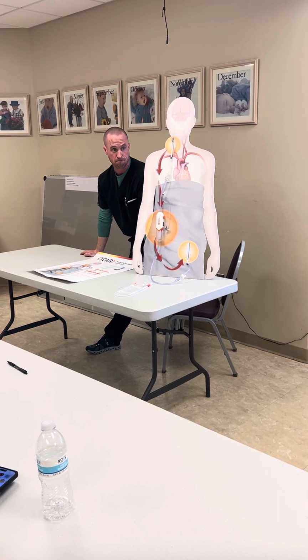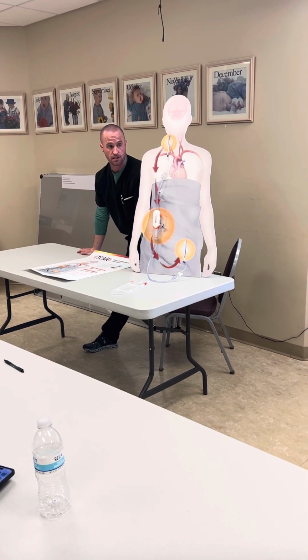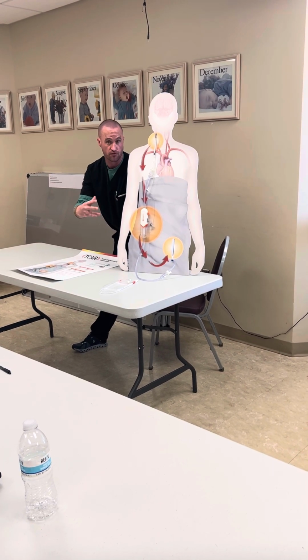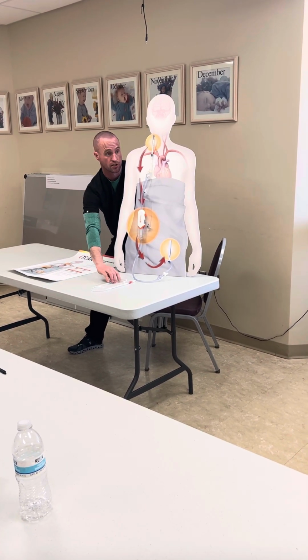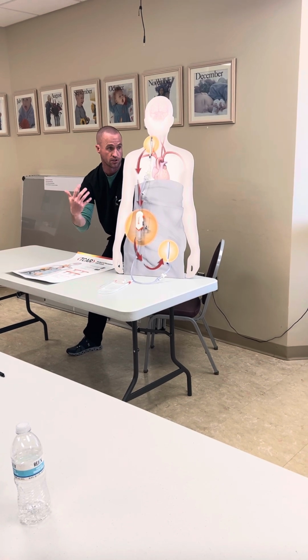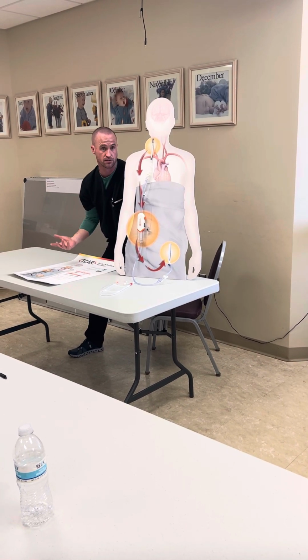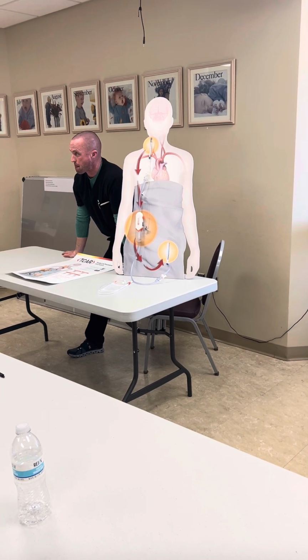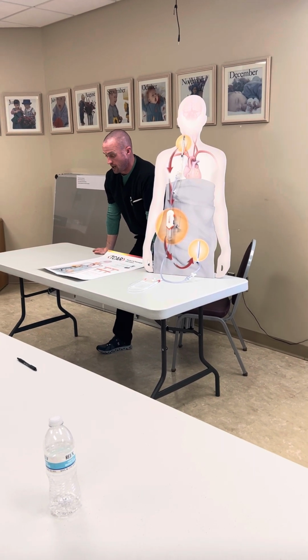So that's it. Any specific questions I can answer? Most of the items are just flush. We're flushing micropuncture kits, we're flushing the stent, and we're flushing the balloon. That's it. Nothing crazy. As far as instruments for the back table, did you go over that?